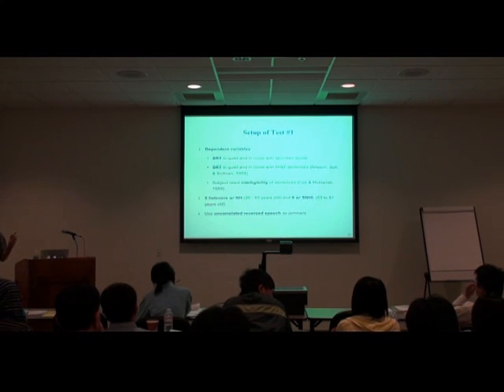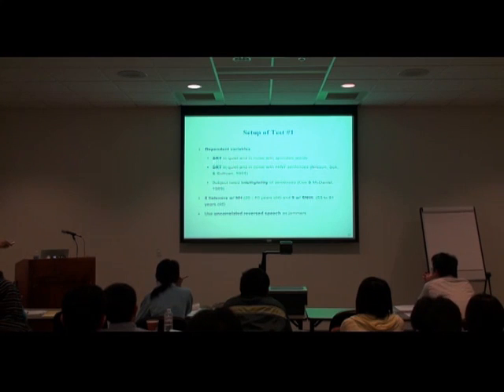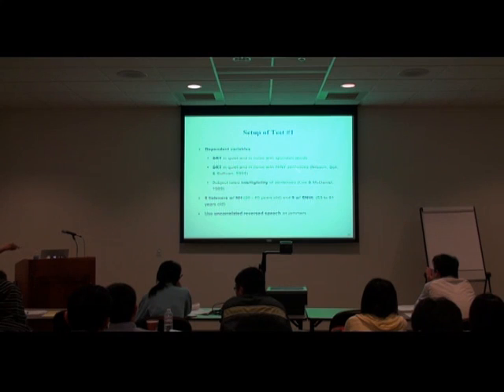So we want to examine whether or not the system works in a real environment, a real-world situation. We're going to measure the speech reception threshold in quiet and noise conditions with various different words and sentences. And then we're going to rate subject intelligibility of the sentences.